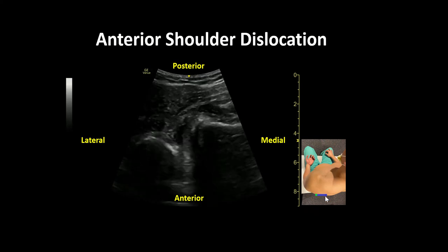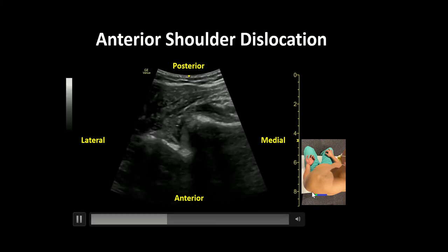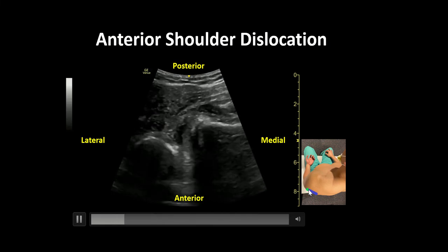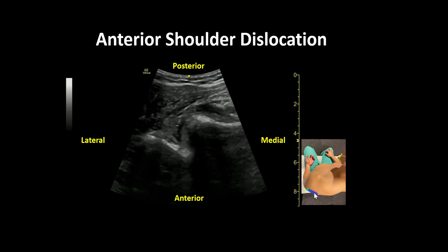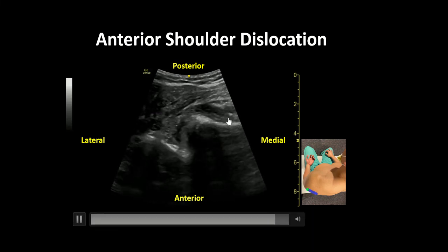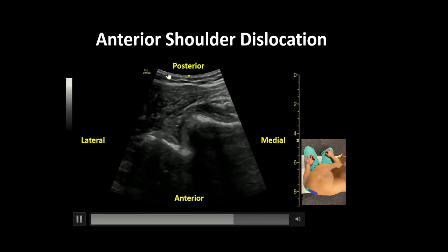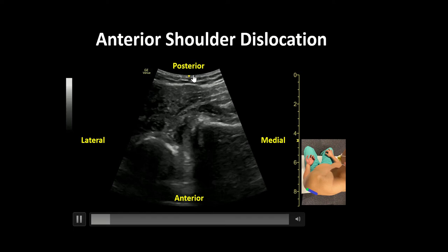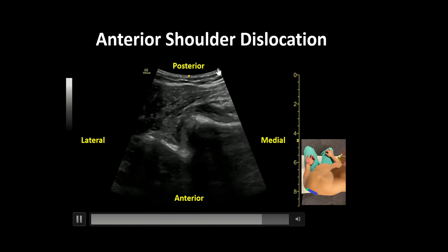The probe is then traced laterally along the scapular spine until the glenohumeral joint comes into view. In this clip we can see that the curvilinear probe is being used, as delineated by the footprint at the top of the screen.